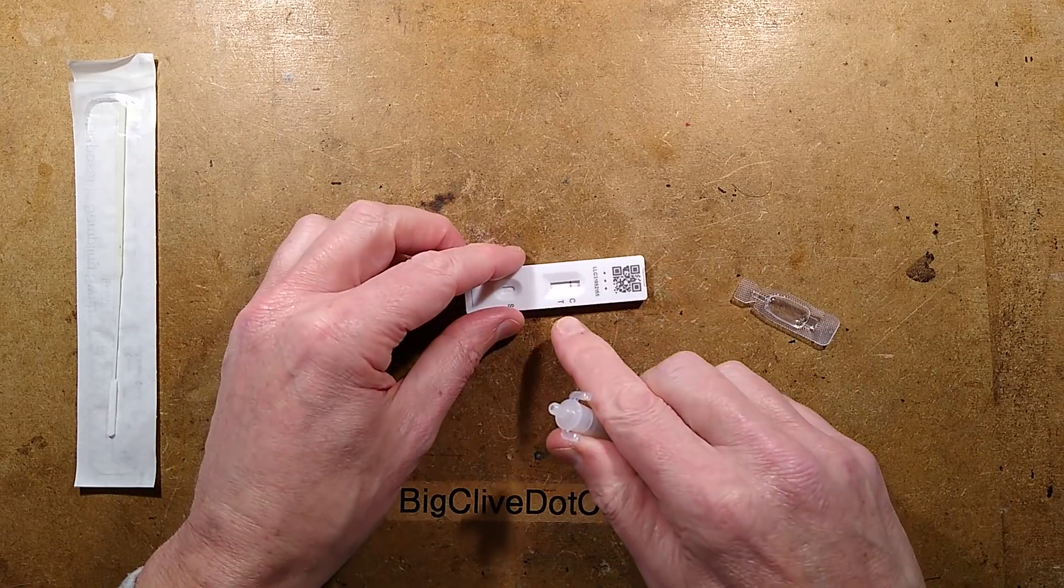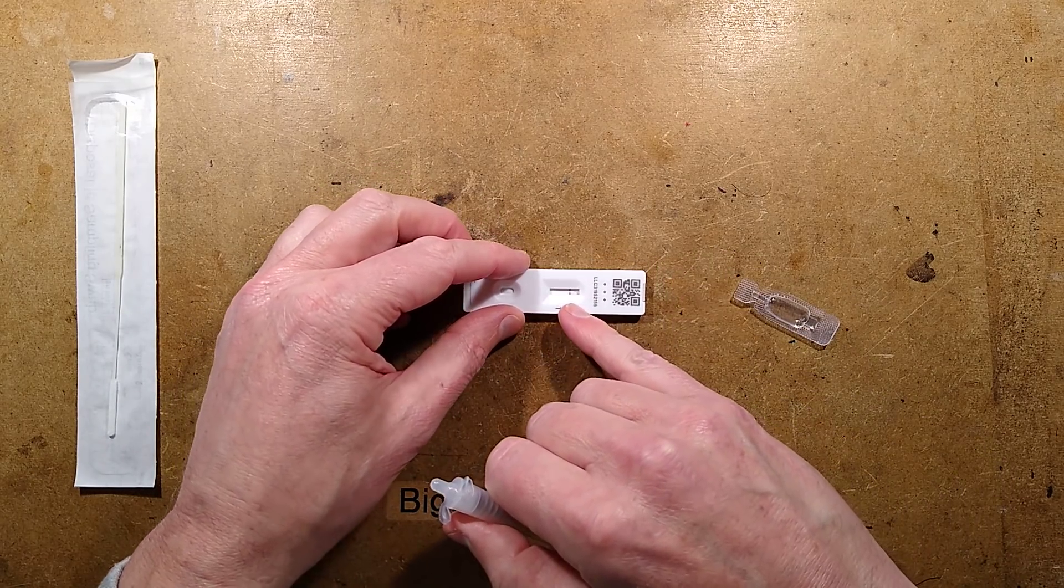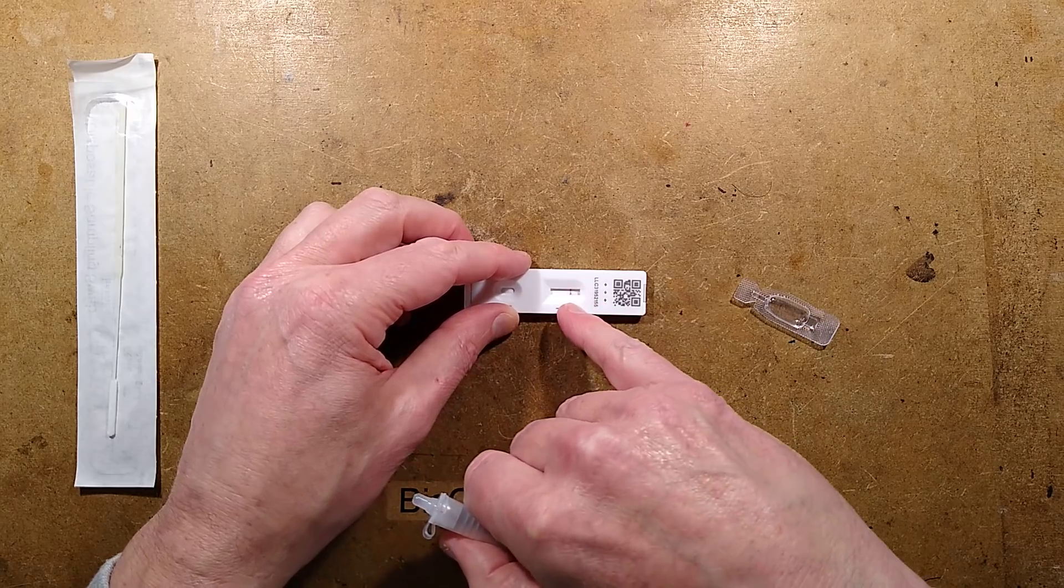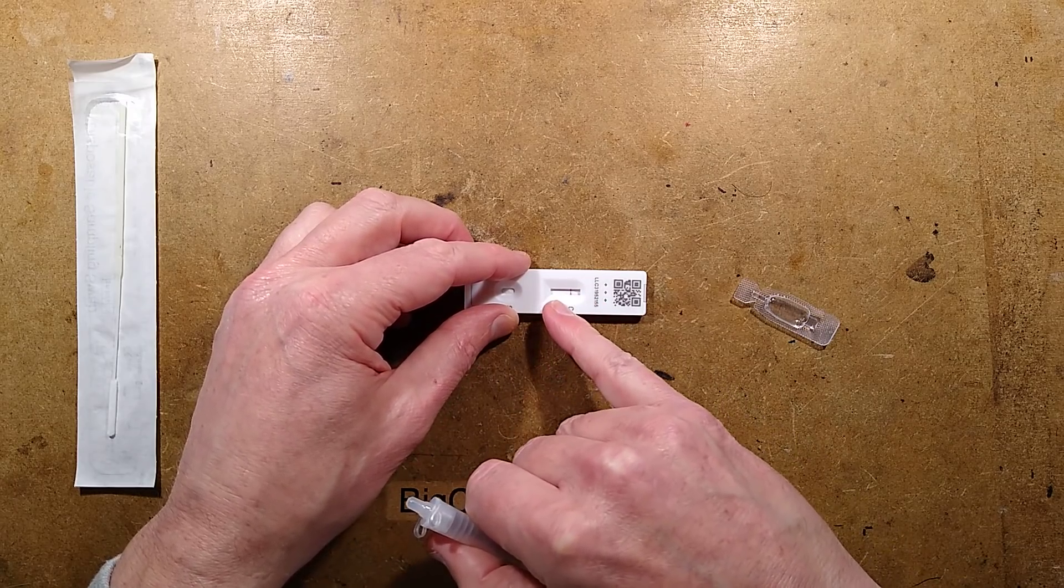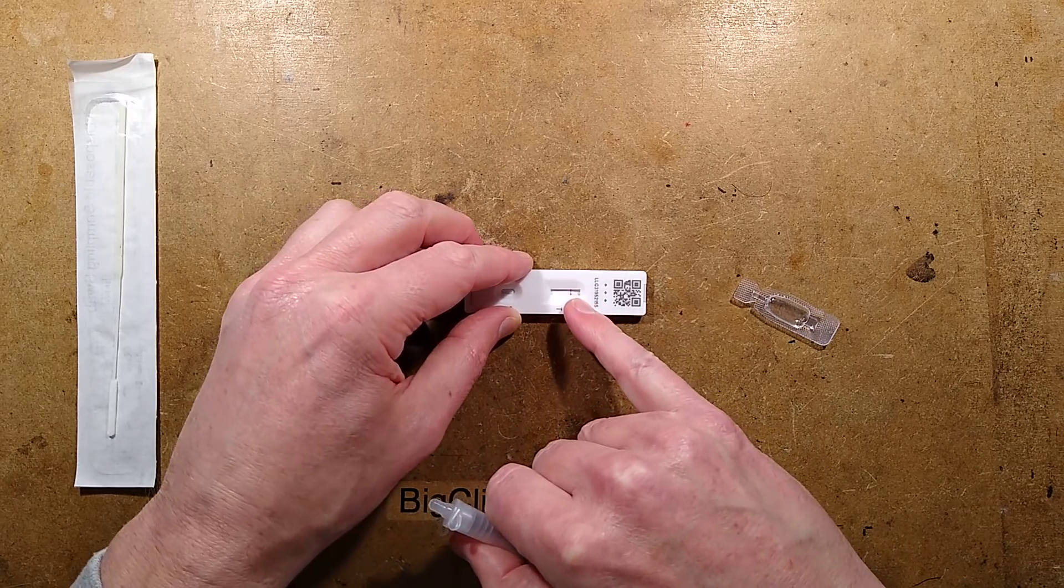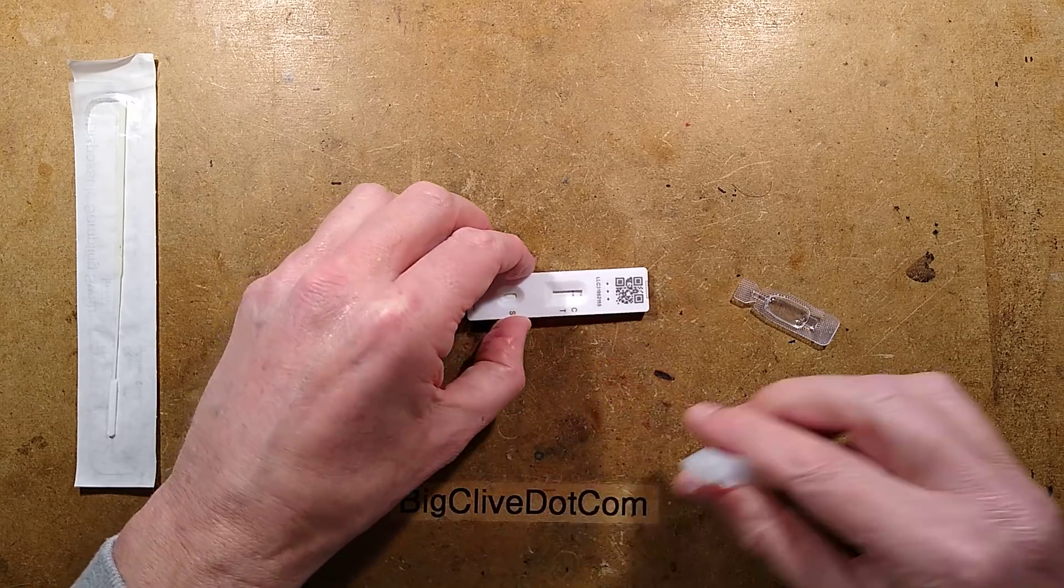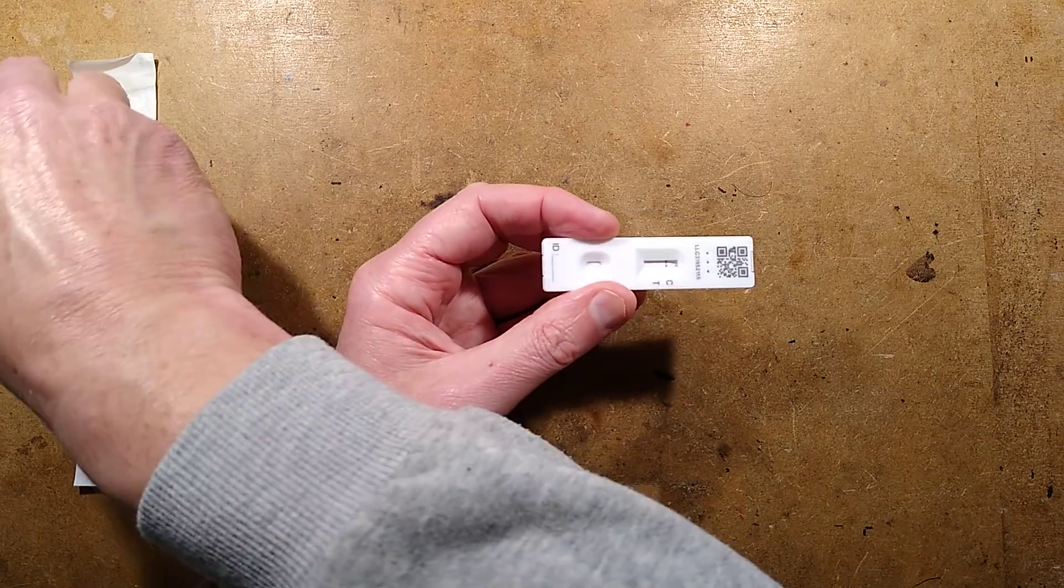You put a couple of drops into this reservoir here and it starts the process of wicking along inside. And after about 30 minutes, you will have an indication - either just the C line will appear, or T for a positive confirmation and the C which is the confirmation line.